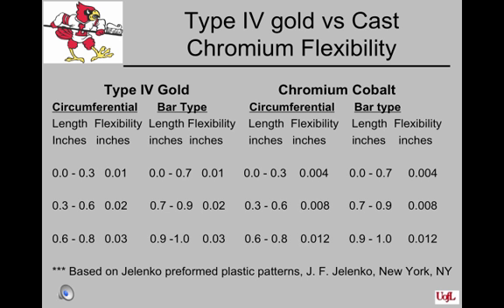The greatest undercut that we can engage with the cast circumferential and bar clasp is the 0.01 inch undercut with the metals that we use today. An alloy exhibiting a higher elastic modulus has greater stiffness, while alloys that display a lower elastic modulus have greater flexibility.